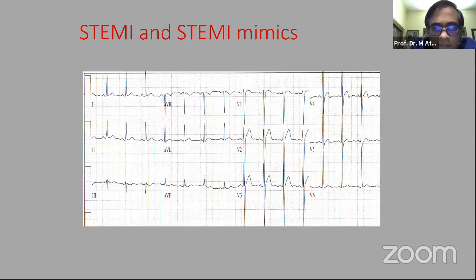So is it wrong for me to say, well, let me get a troponin? Yes. And then follow up troponin after a few hours and get an echo. Yep. At this point. Okay. And if all those come back normal, then I can more or less say this is due to LVH, right? Yep. Now, the question would be, if this patient at this point was having ongoing chest pain and diaphoresis, what will you do then? Yep. So the clinical part is so pressing that we'll have to work on that.